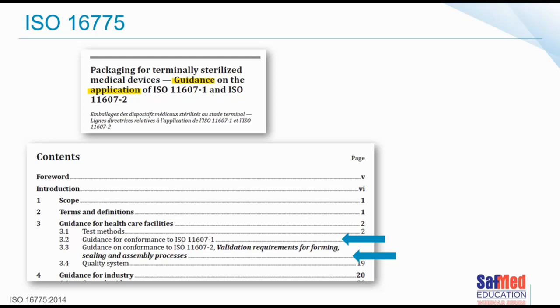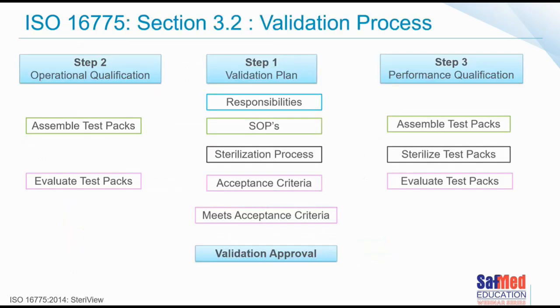We're talking about forming and sealing and validating the process as a whole and bringing it down specifically to SteriReels as well. But these concepts you need to bear in mind when you are doing the same thing for wrapping and the same thing for containers. Okay.